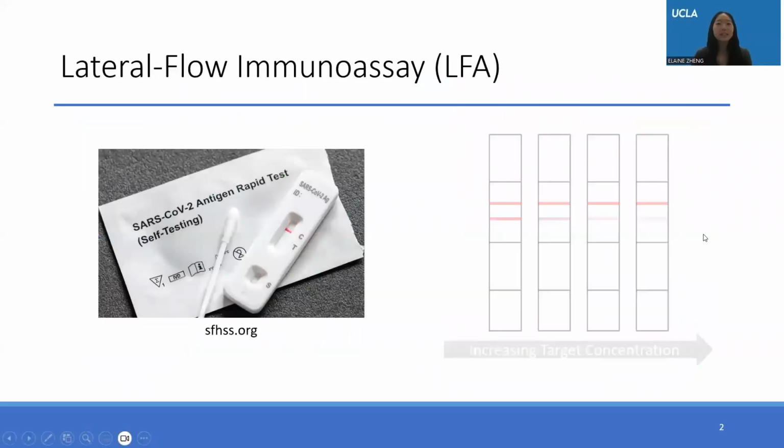The COVID-19 pandemic presented a major issue. How could we quickly test individuals to determine if they were infected? One solution was the COVID rapid antigen test, which is cheap to manufacture and easy to interpret, making it well suited for mass distribution and use in low resource settings.